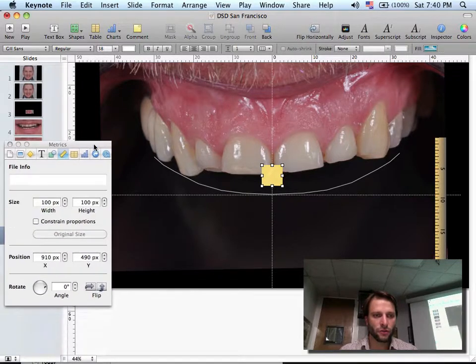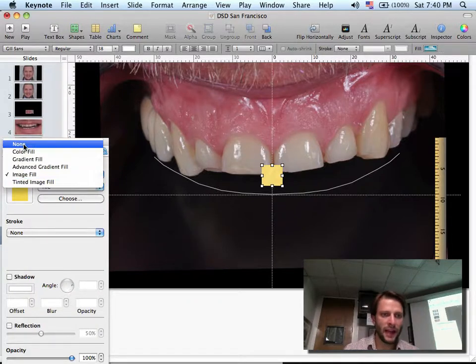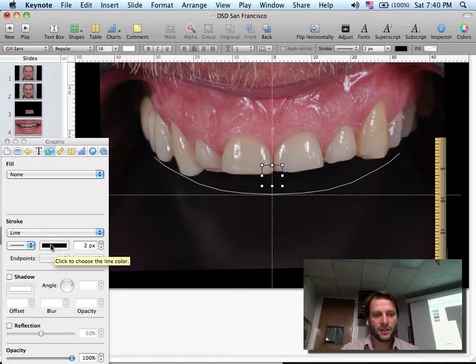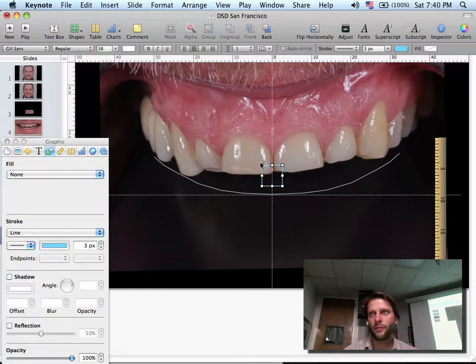To do that we have to go to Inspector and click on Graphic, the green little icon here. First I'm gonna go to Image Fill and select None. Second, I'm going to go to stroke and select line. Once I select line, I want to click on this little square here, make sure it becomes dark. When it becomes dark, I can pick the color. A nice visible color, light blue for example. And then this is the thickness of the line. I want to make it a little thicker, so 3 pixels of thickness should be fine. And I can close the window of the colors. So now I have my square.